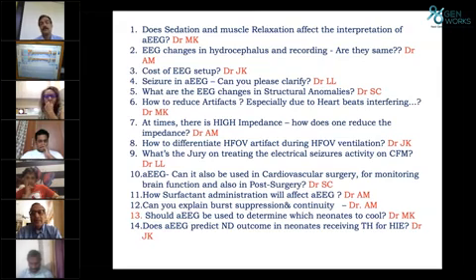I think babies who have a lot of hair are the ones that cause more problems. But I think initial skin prep is key, or if you just can't fix it, you can take that individual lead off if it's one lead causing a problem and reapply it. I think that's the best way to address it.